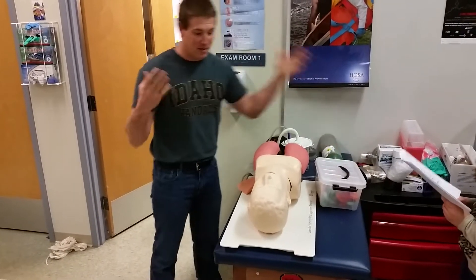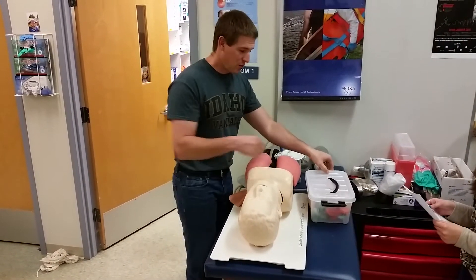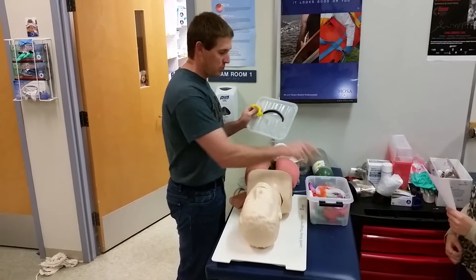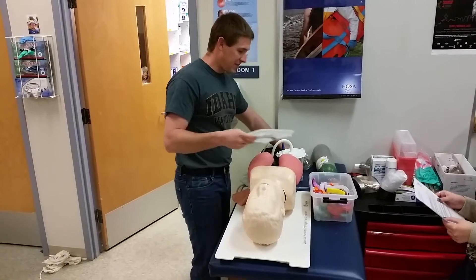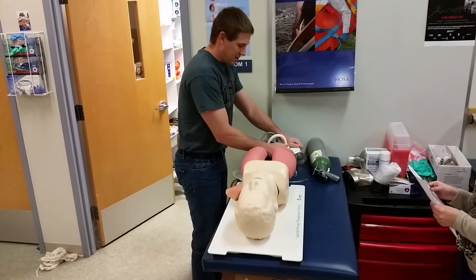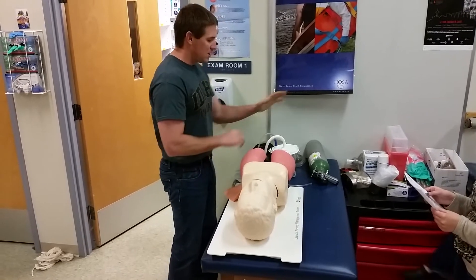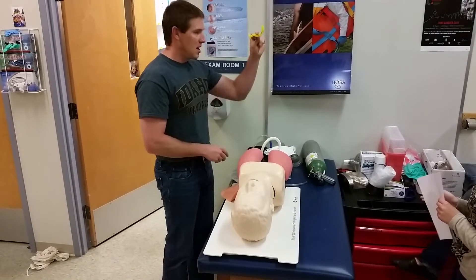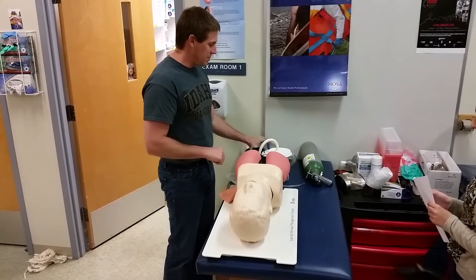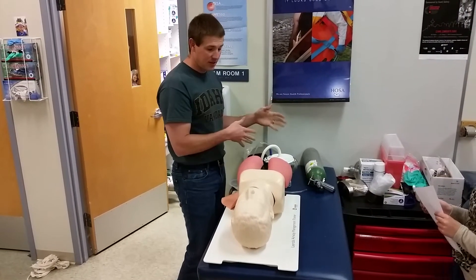At the beginning of your exam, they'll ask if you'd like to go over your equipment — say yes. Test the different OPA sizes to make sure you have the correct one; yellow is correct here. Make sure your suction is ready and working. Organize your equipment in use order: suction first, then OPA, then BVM, and oxygen tank last — so you know you've used everything you're supposed to.